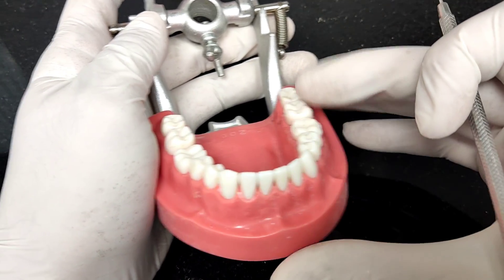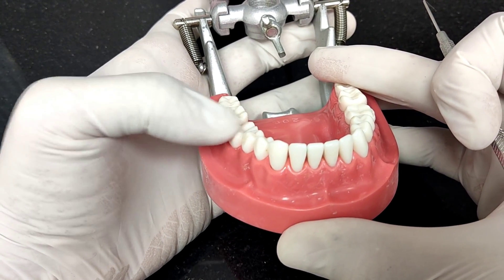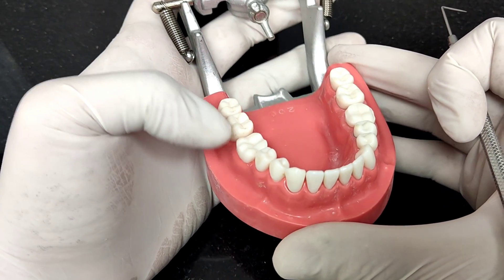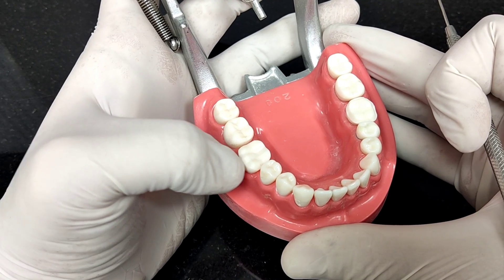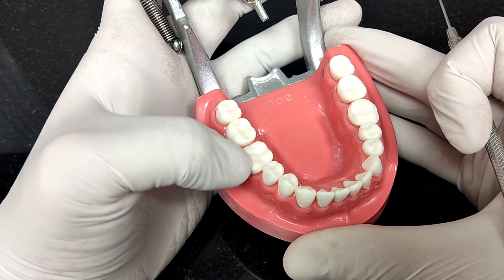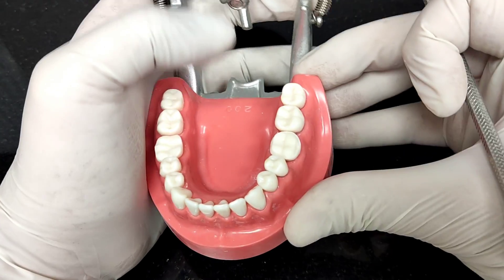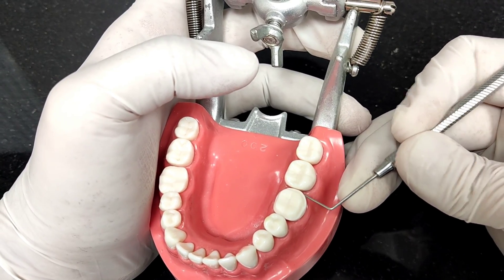This is the second design. As you can see, occlusal preparation is done and a functional cusp bevel is placed, but there is no deep chamfer margin. This is a classic table top restoration.